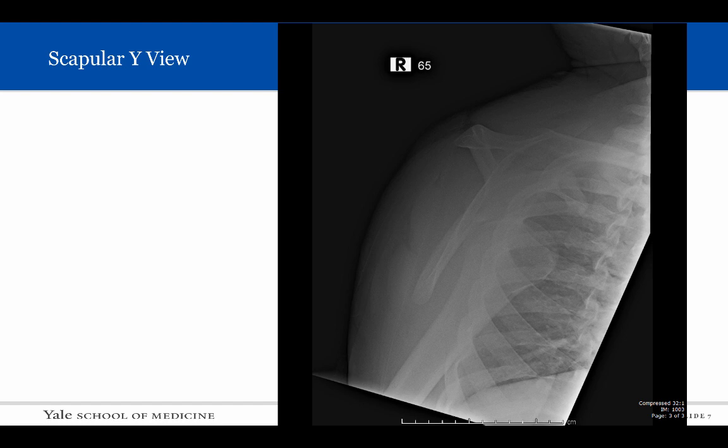We cannot definitely determine whether the dislocation is anterior or posterior on those views alone. The scapular Y view radiograph shows us the orientation of the humeral head to the glenoid. The Y is formed by the intersection of the scapular body, scapular spine, and coracoid process. The glenoid fossa lies at the intersection of these lines, and the humeral head is positioned anterior and inferior to the glenoid fossa.